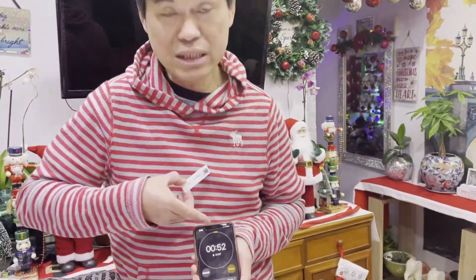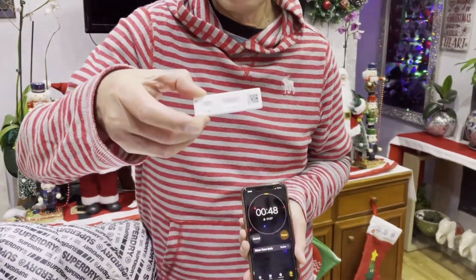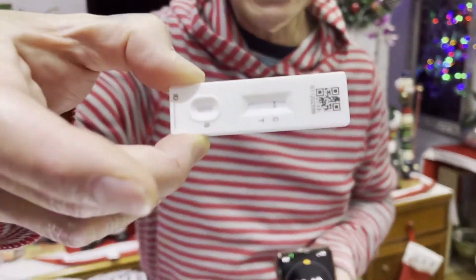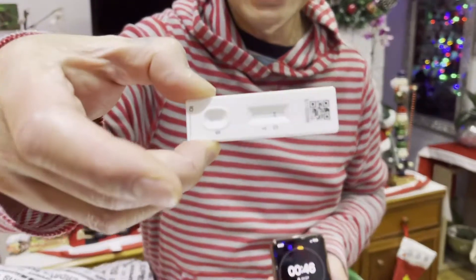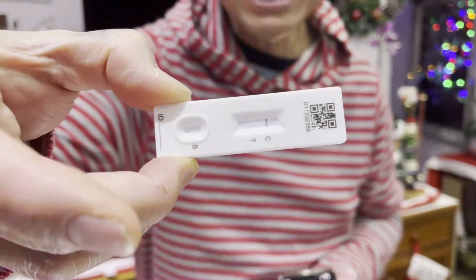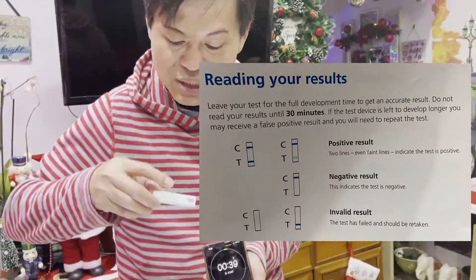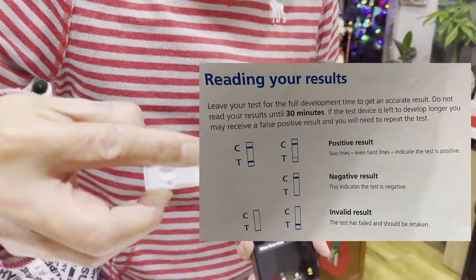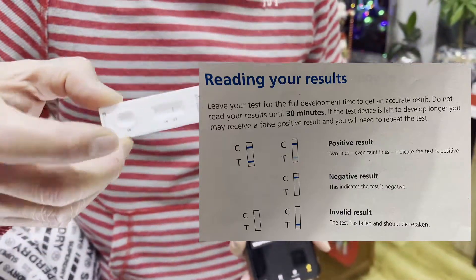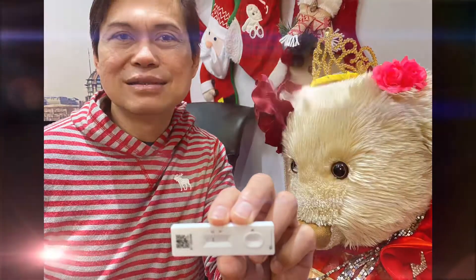So this is the result — it's nearly 30 minutes. My result is negative! Negative, negative, negative — finally, thank God. See, there's only one line, which means negative. Two lines would mean positive, but I got only one line, so it's negative. Thank you.